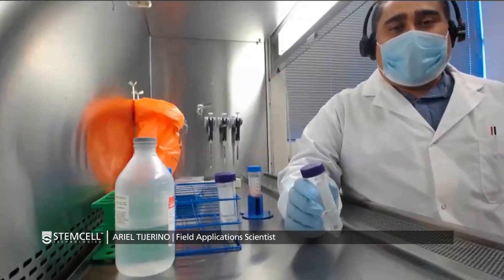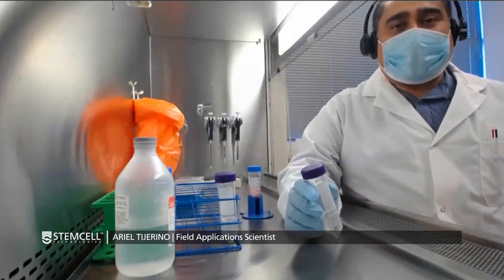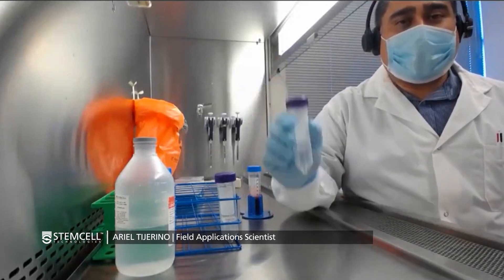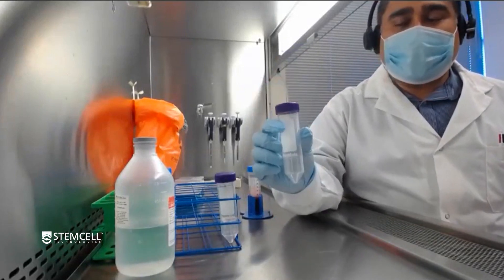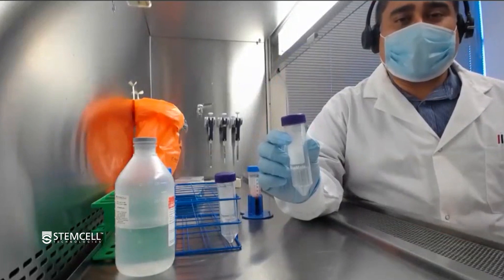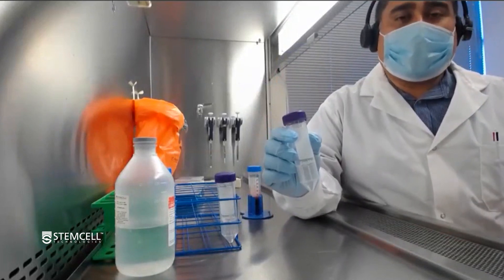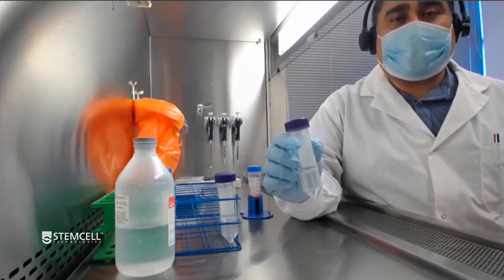Hi, everyone. My name is Ariel, and we'll be going over today how to process peripheral blood into PBMCs using CEPMATE. CEPMATE is a unique product from Stem Cell Technologies that helps make the process of going from whole blood to PBMCs faster and easier.